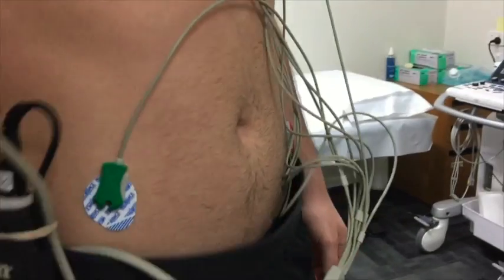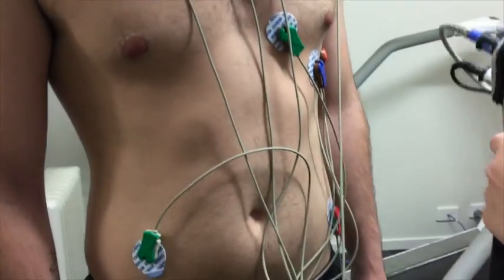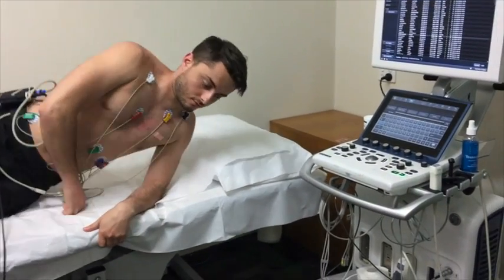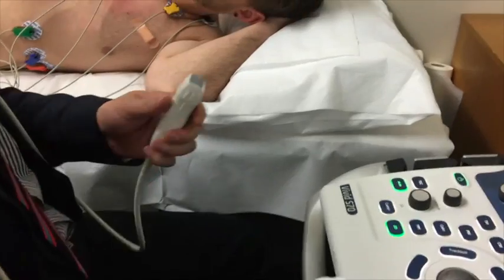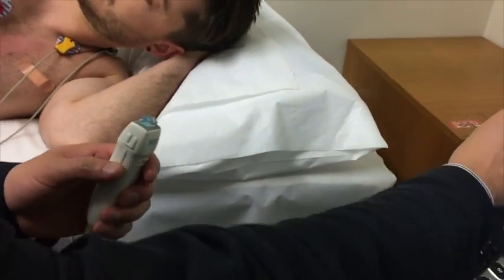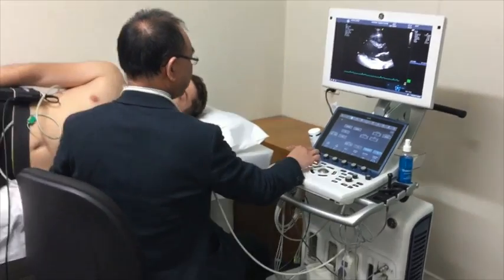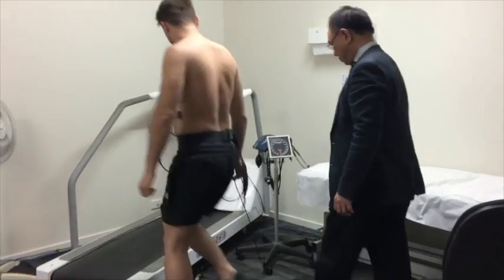Occasionally the cardiologist will perform the ultrasound himself. In the stress room, your ECG electrodes will be connected to the ECG monitor, and you will be asked to lie down on the bed for the initial ultrasound imaging of the heart. An ultrasound probe called a transducer will be held against your chest in various areas using special gel to obtain initial rest images.